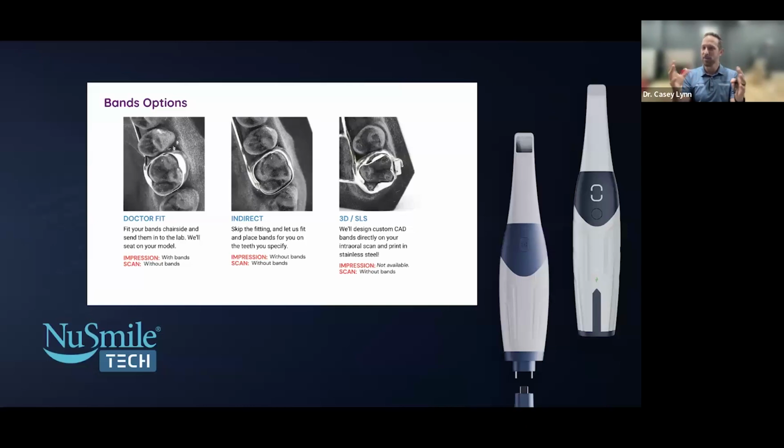So I was really concerned doing those at first because I was like, this isn't going to be retained. These kids are going to eat a Laffy Taffy. They're going to chomp on a Jolly Rancher. Like, this is going to pop off. I've had way fewer debonds with that, using a Fuji Ortho Blue cement, like a traditional ortho cement that is light curable and tack curable, versus just a traditional band and loop.